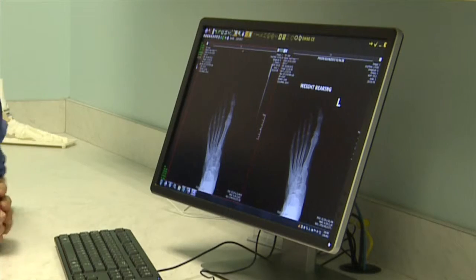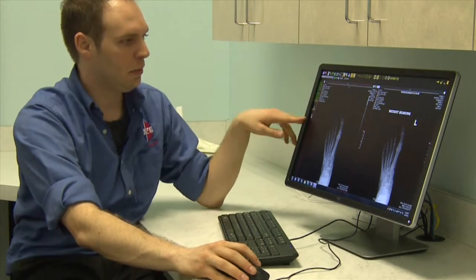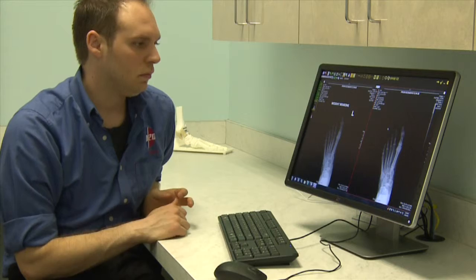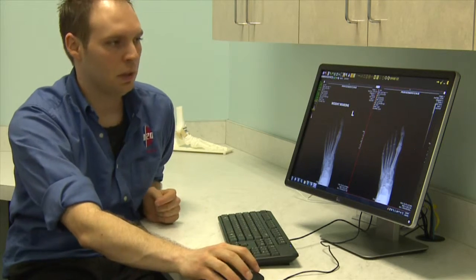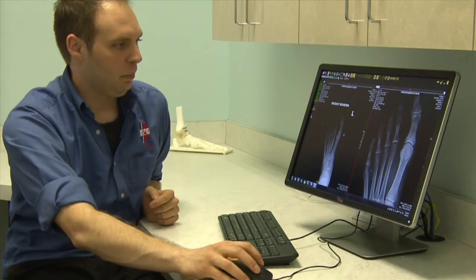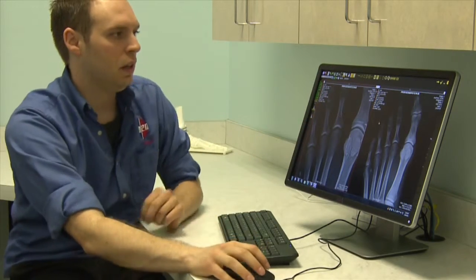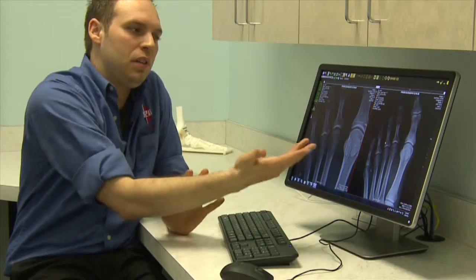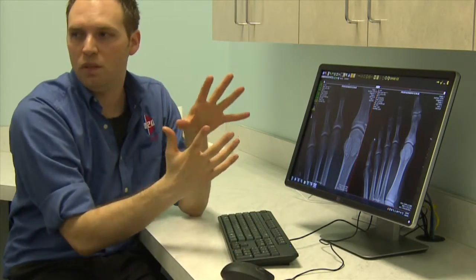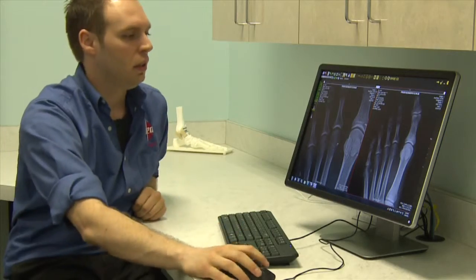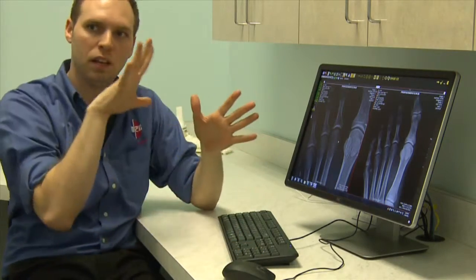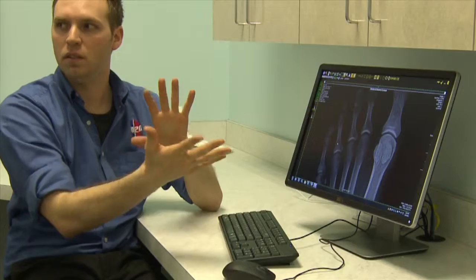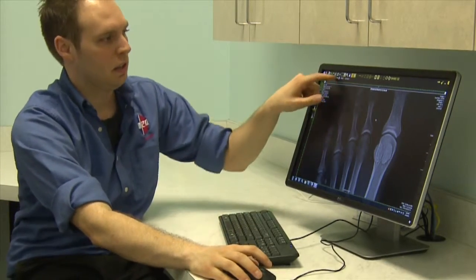You can double-click one image or drag it into a panel. When you're in a panel, you can zoom in on that one; when in the other panel, same thing. The red dotted line shows your currently active image. A neat trick: double-click an image while in multi-view to temporarily bring it up closer in single view — you're still in your multi-view layout underneath. Double-click again to go back to side by side.